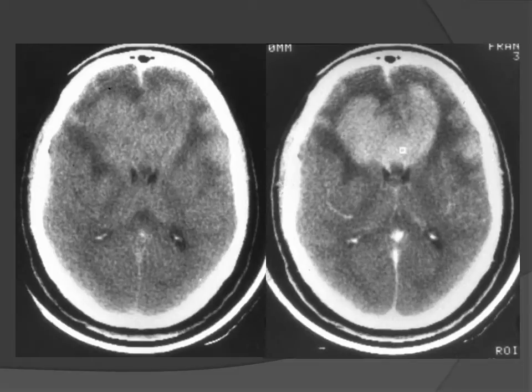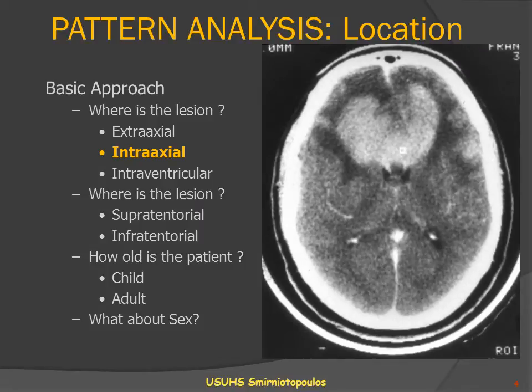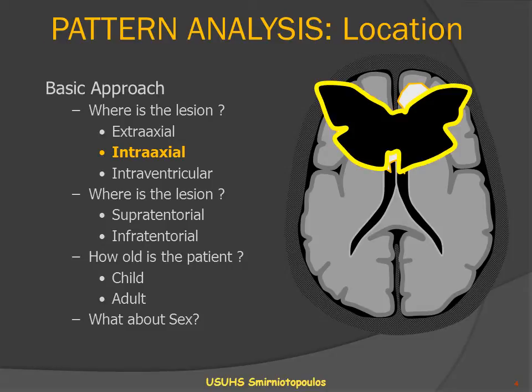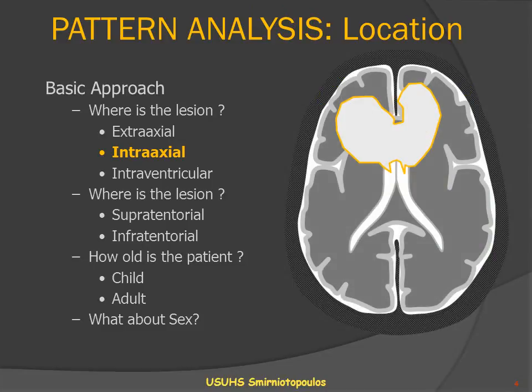Here we have, on these two CT scans, an example of a classic butterfly lesion. The non-contrast CT scan shows a fluffy, relatively homogeneous lesion of abnormally increased attenuation with some surrounding vasogenic edema. The same lesion demonstrates contrast enhancement. In the basic approach to the lesion location, we can identify that this is intraaxial and it is within the corpus callosum, spreading from one side to the other. This is the classic appearance for an infiltrating neoplastic process, such as primary CNS lymphoma or glioblastoma multiforme, both of which are well known to be butterfly lesions.